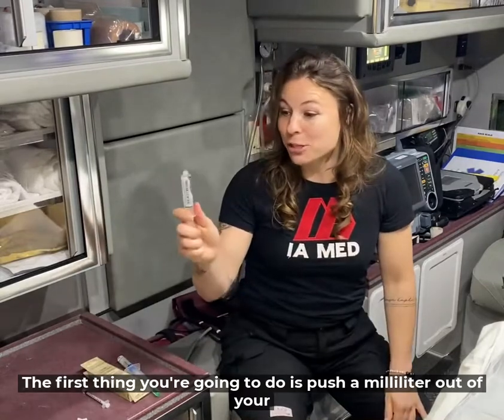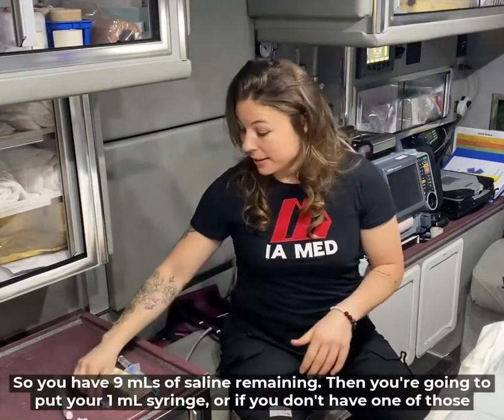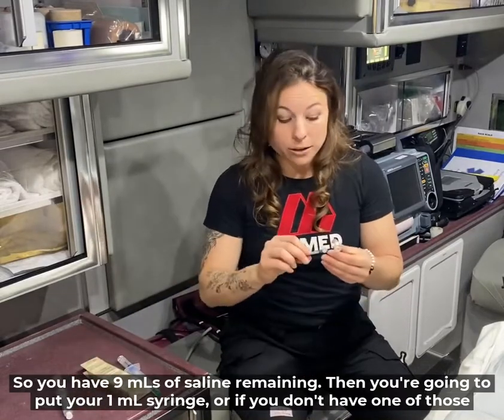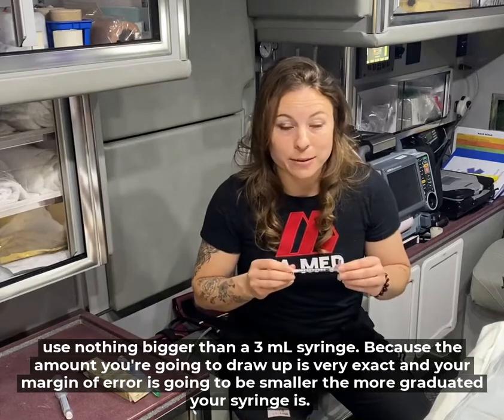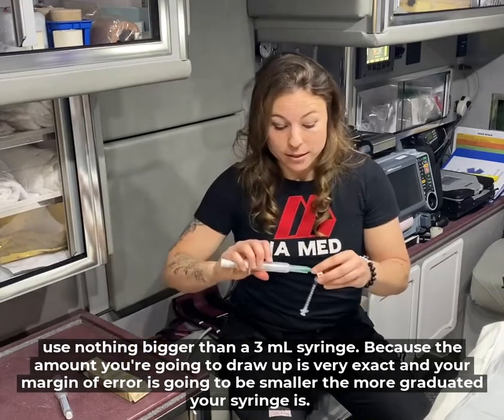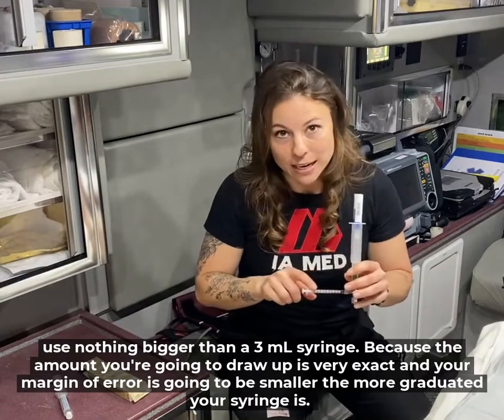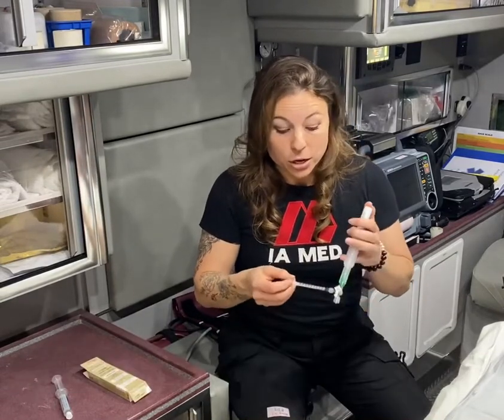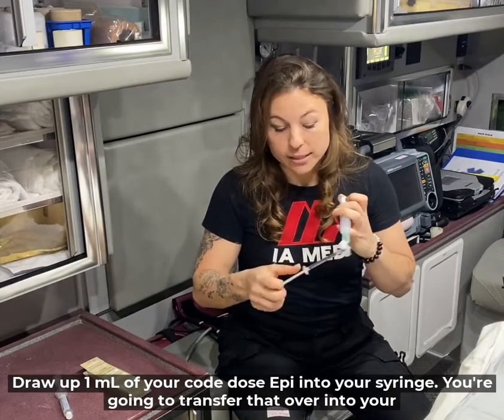The first thing you're going to do is push a milliliter out of your flush so you have nine mils of saline remaining. Then put your one milliliter syringe — or if you don't have one, use nothing bigger than a 3 mil syringe — because the amount you're going to draw up is very exact and your margin for error is smaller the more graduated your syringe is. Draw up one milliliter of your code dose epi into your syringe.